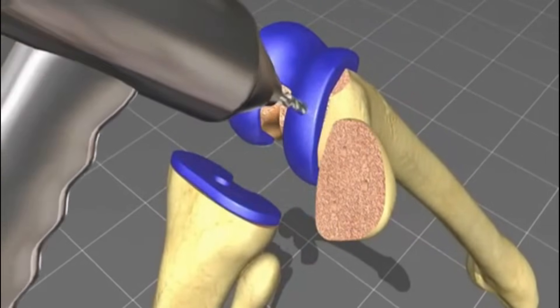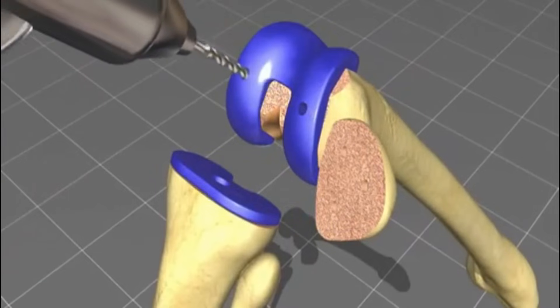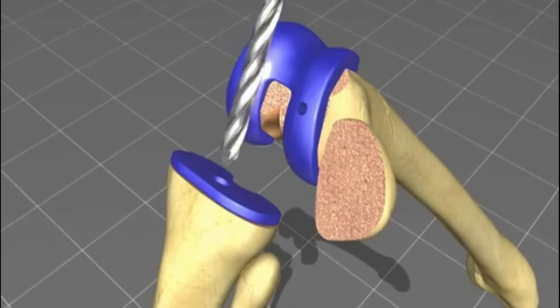Additional drill holes improve the fixation of the prosthetic device into the femur and also at the tibial side.